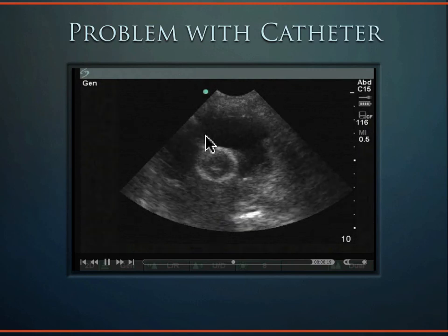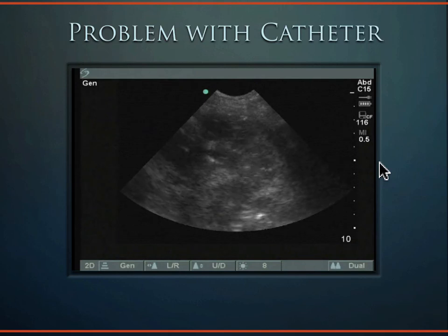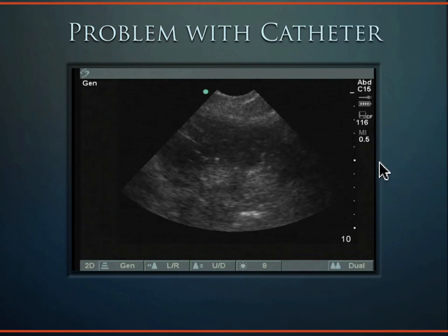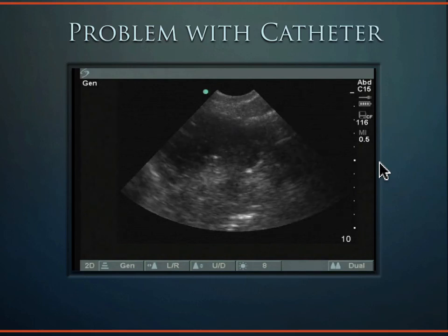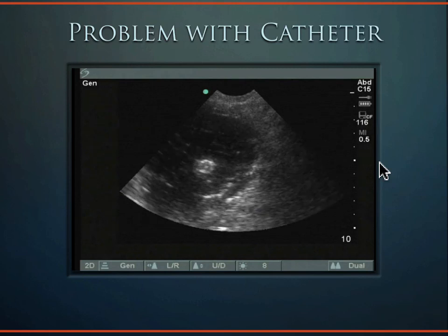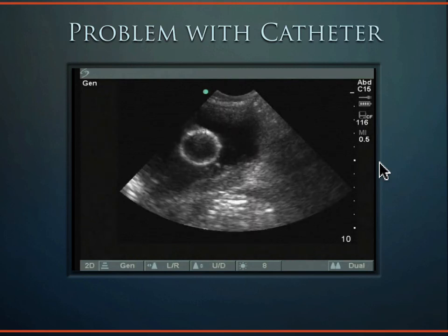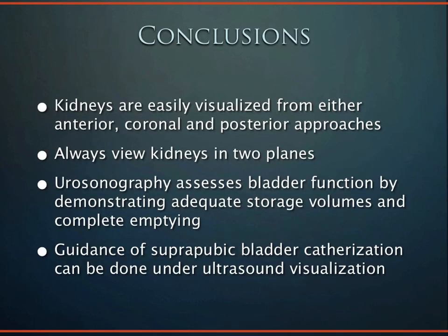And so I brought a needle down under ultrasound guidance, and I got on that balloon. See the needle on the balloon there? And then, boom, we popped it. And then we're able to take the catheter out, and we put a new catheter in there and flushed out all those pieces of balloon particle that's floating around in his urine and got it out of there. But so that's the idea. That's the clinical correlate I wanted to leave you guys with.